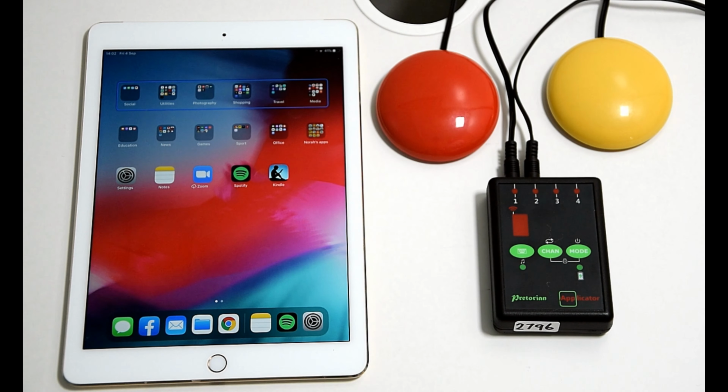And then the final little addition that we want to show you today is the standby mode. So a lot of the feedback we got from our NHS clients and people that we work with, where they take the applicator from one place to the next and work with several people using the applicator, was that they would put it in a bag and it would still be on, and the buttons would be pressed when it's rummaging around in the bag, and they would change their settings and they'd have to reset it back up when they get to the next client, etc, etc.